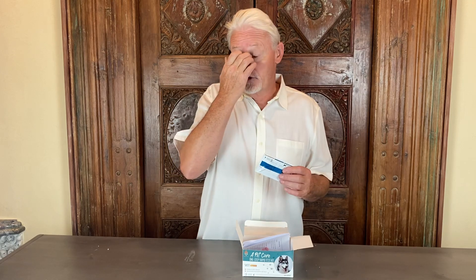Then there's a test for parvo — of course a deadly disease. If you have a dog with parvo you want to find out very quickly so you can quarantine that animal.